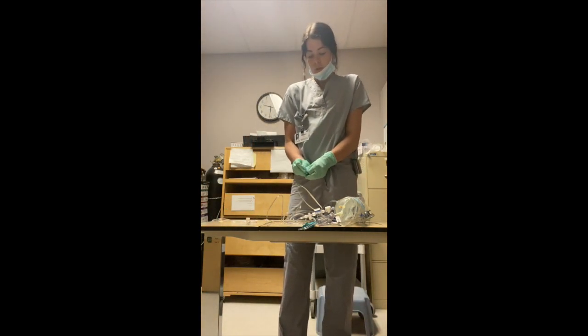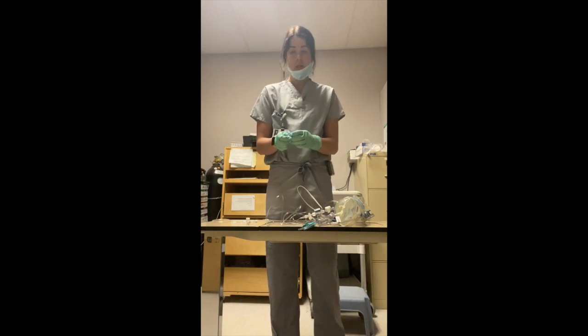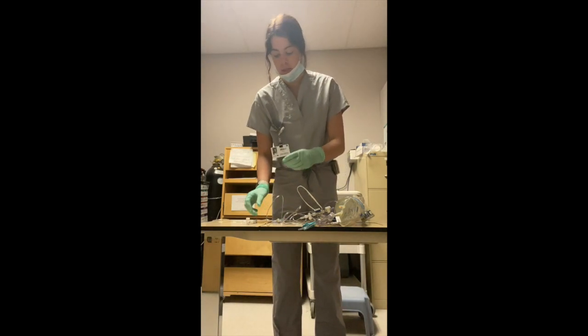All the ones that we just flushed have holes in them, so they need to be replaced by the dead ends.